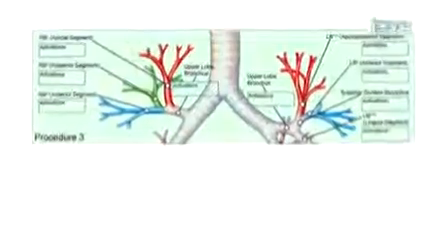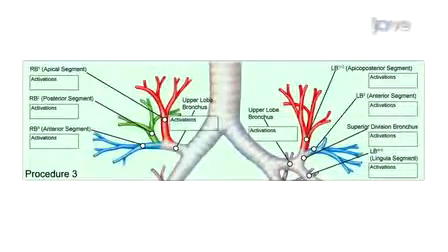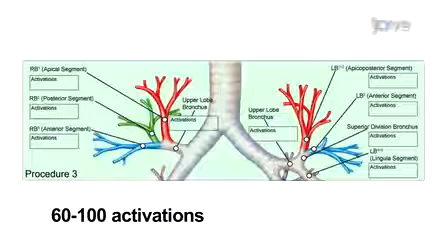Bronchial thermoplasty for the upper lobes requires additional time for the treatment, as these regions are typically treated within one treatment session covering both upper lobes. The procedure performed is identical to that described above, but requires additional time because it involves navigating the tortuous anatomy of the upper airways, and additionally, it covers more area than either lower lobe. Depending on patient size and anatomy, a range of approximately 60 to 100 activations is performed in the upper lobes.